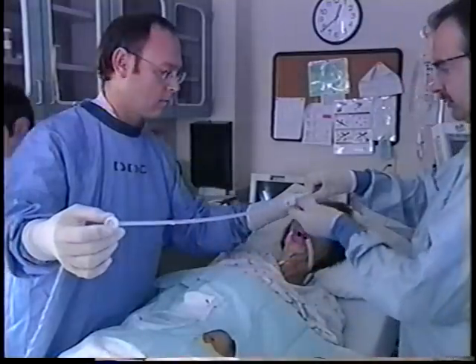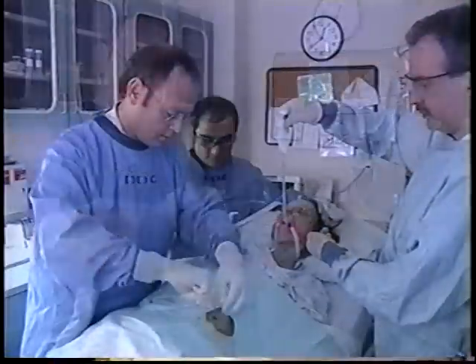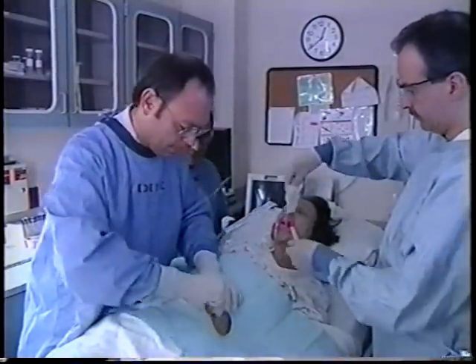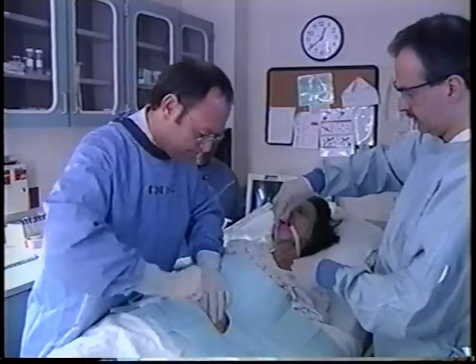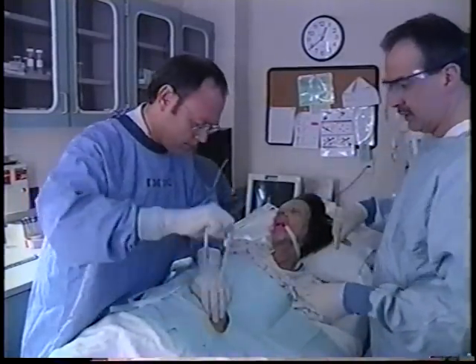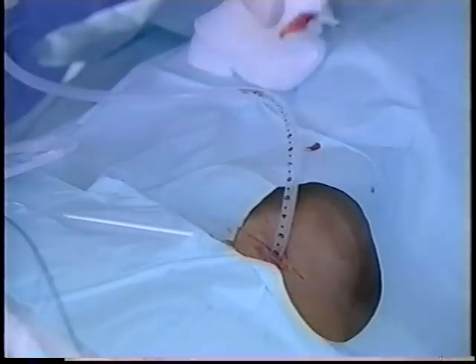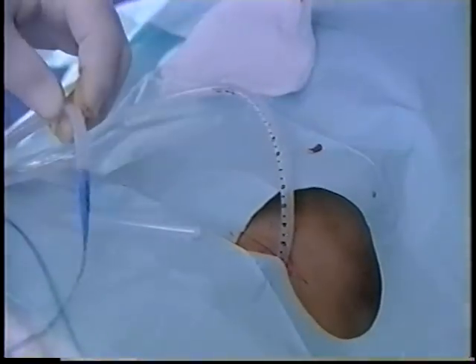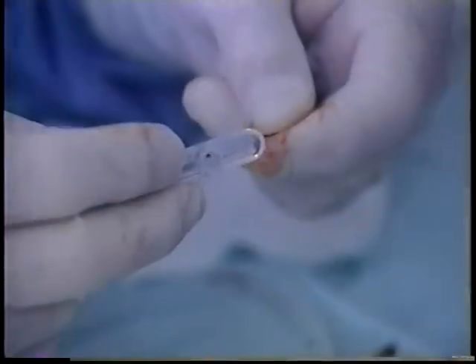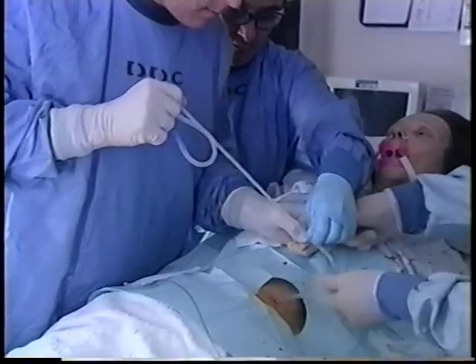The tube is lubricated, and the insertion wire segment at the abdominal wall is continuously pulled until first the dilating segment and then the PEG tube itself exits the incision. The tube is pulled until the internal bolster seats snugly against the gastric mucosa. The insertion wire is cut, and the external bolster is advanced over the PEG tube to a point approximately 1 to 2 centimeters from the abdominal wall.